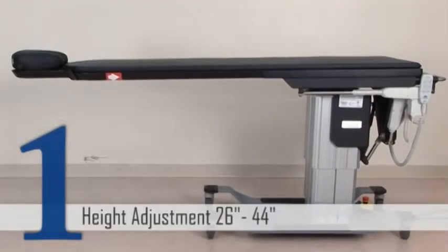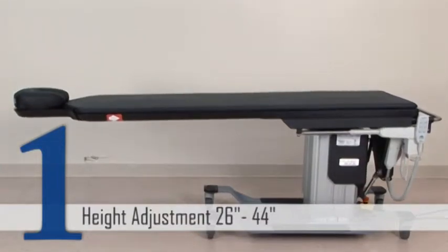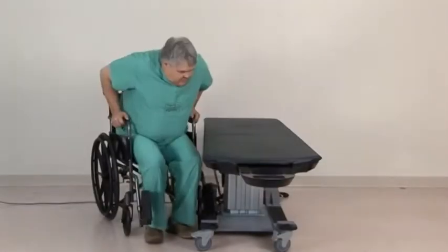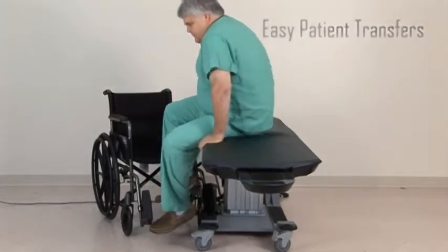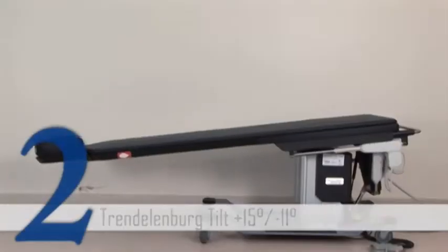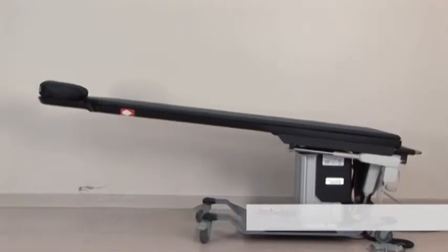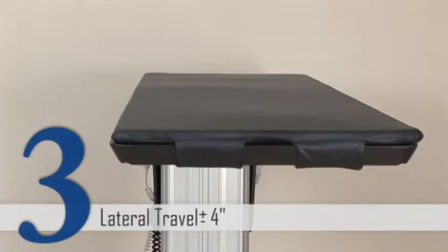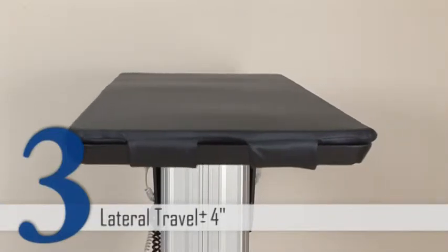The industry leading height range of 26 inches to 44 inches gives you the flexibility to work at the best height and make patient transfers safer. The Trendelenburg feature has a plus or minus 15 degree to negative 11 degree range. With a lateral travel of plus or minus 4 inches, adjustments can be made on the table quickly.